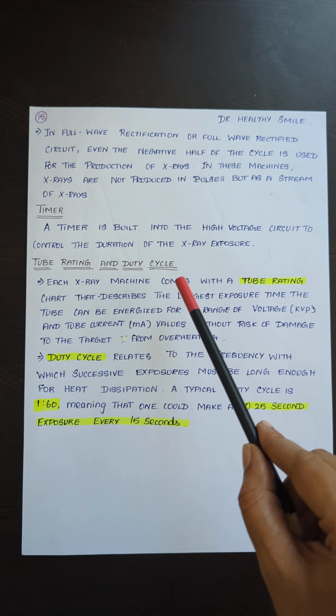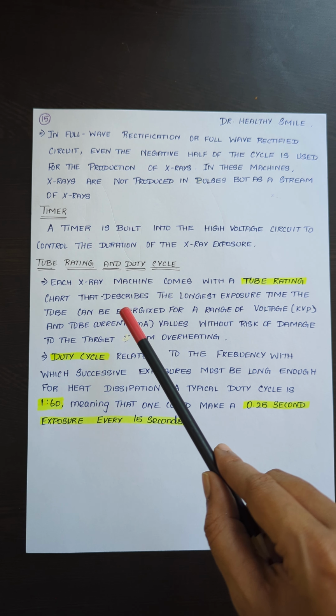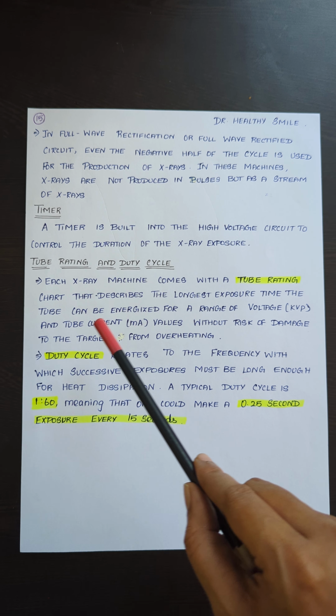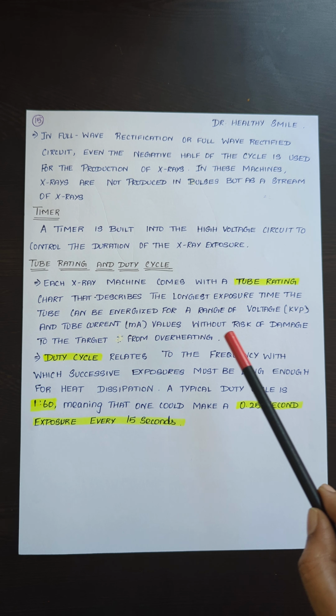Tube rating and duty cycle. Each X-ray machine comes with a tube rating chart that describes the longest exposure time the tube can be energized for a range of voltage and tube current values without risk of damage to the target from overheating.